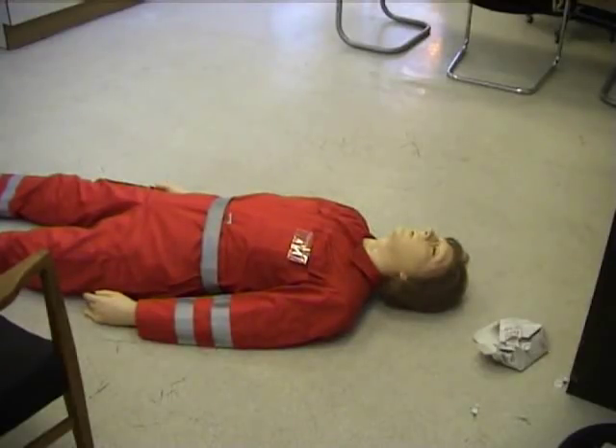Ok, I'm entering the room, looking for any sign of danger. Alright, it's over here. I can see your phone there.